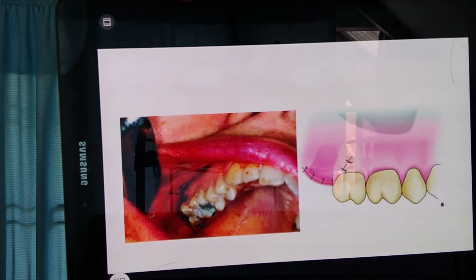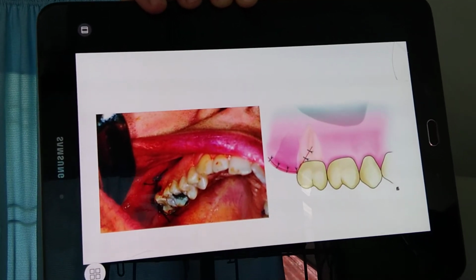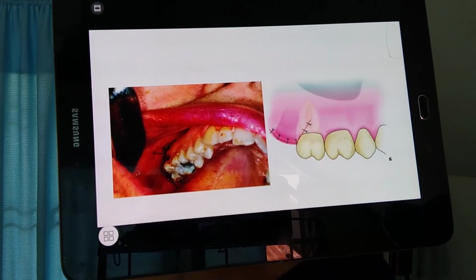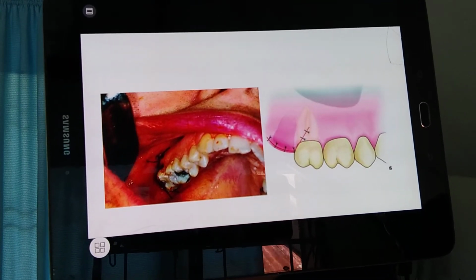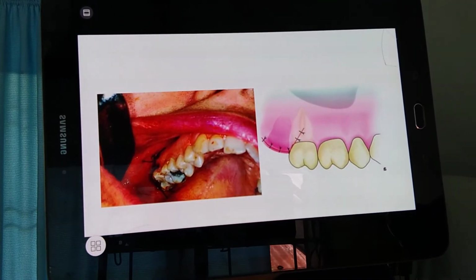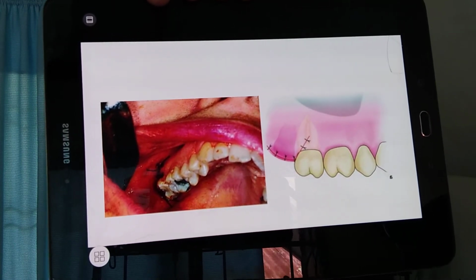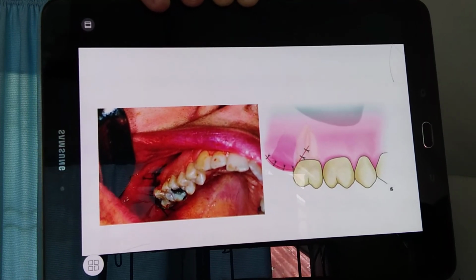Care of the wound and suturing are performed in the same way as described for all other cases of impacted teeth. Namely, only if considered necessary, or for example if there are sharp bone edges, the alveolar margin is smoothed using rongeur forceps or a bone file, and then the lingual and buccal plates are compressed using your finger pressure.